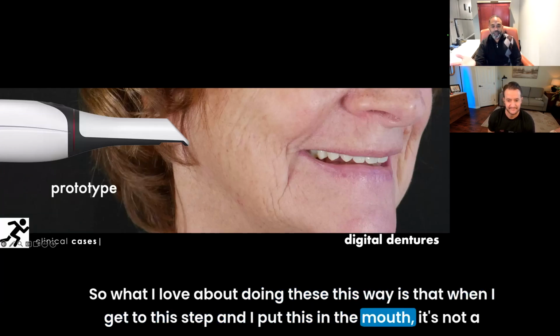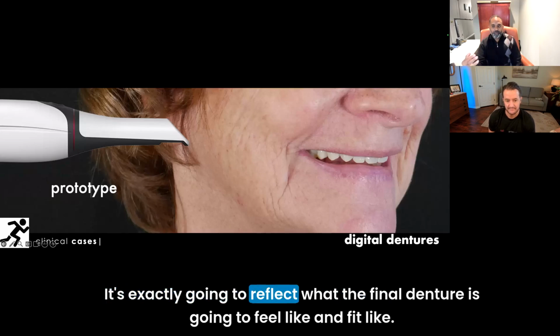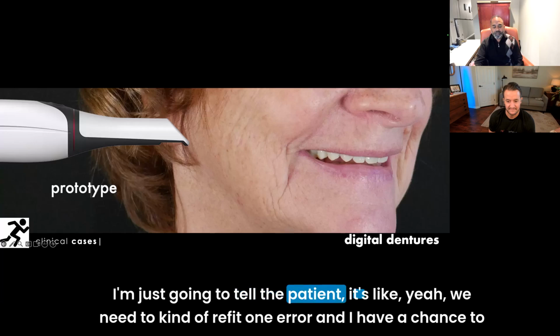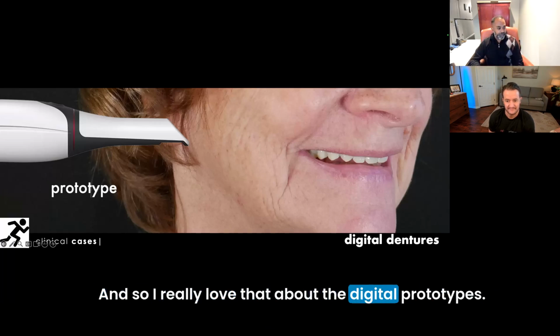So what I love about doing these this way is that when I get to this step and I put this in the mouth, it's not a try-in, it's a prototype. It's exactly going to reflect what the final denture is going to feel like and fit like. So if I have 2 sore spots that I have to adjust on this prototype, those are the exact 2 sore spots that I'll need to have on the final. If I put this in and it just falls out for some reason, I'm not embarrassed because I already have the final. I'm just going to tell the patient, oh yeah, we need to refit one error, and I have a chance to do another wash and maybe fix some error that I made. And so I really love that about the digital prototypes.